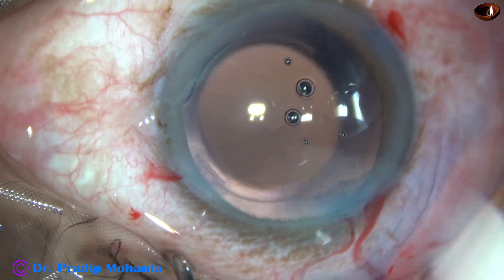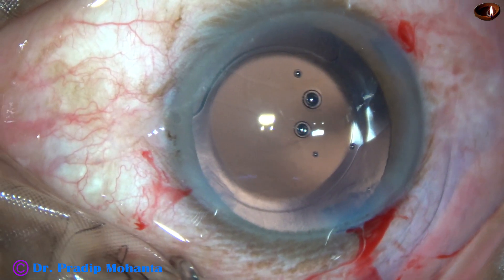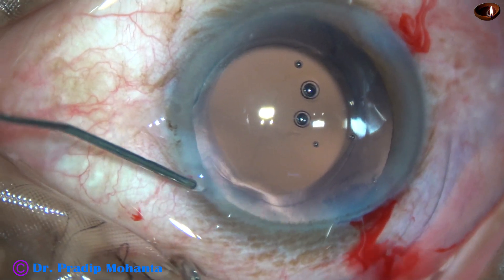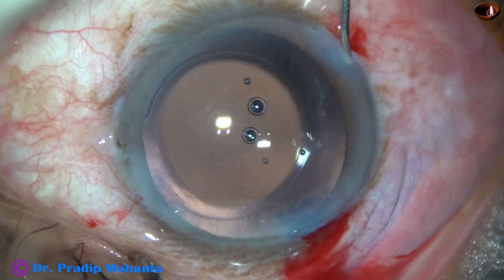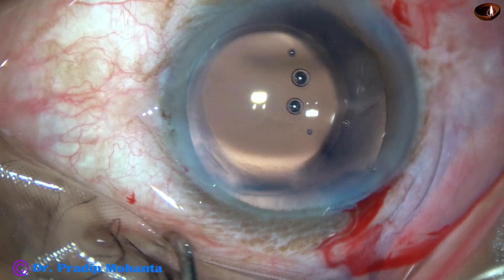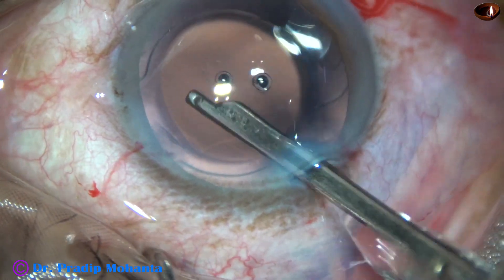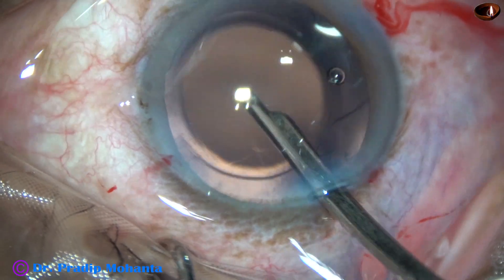Now, I am using the irrigating probe to irrigate the anterior chamber, and whatever visco is there is coming out. This is a bit of moxifloxacin. And this is stromal hydration — hydrating the corneal stroma on either side of the paracentesis wounds so that these stab incisions get closed. A final lavage of the anterior chamber decreases the incidence of endophthalmitis to a great extent.